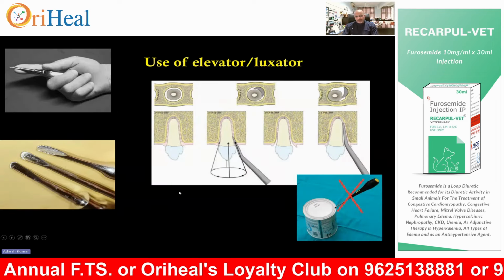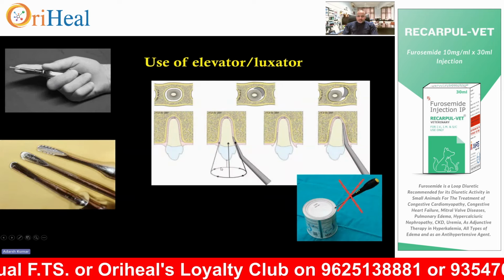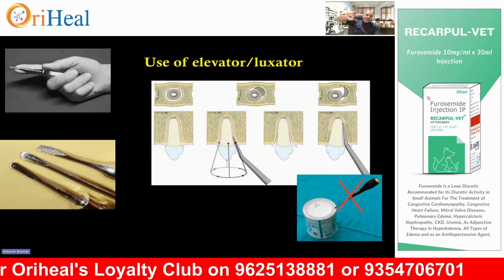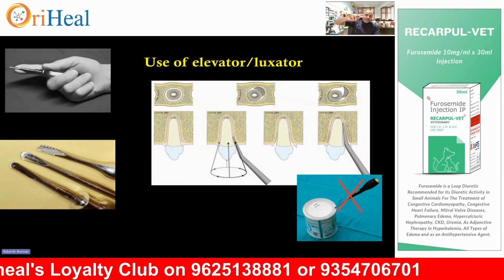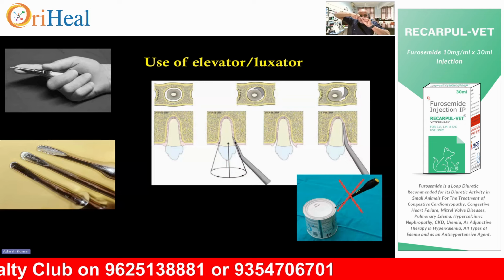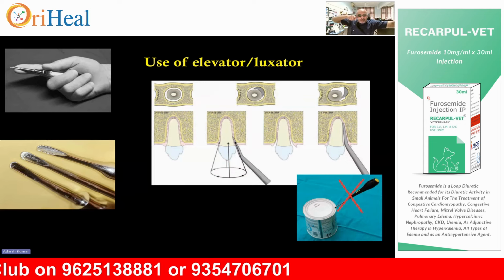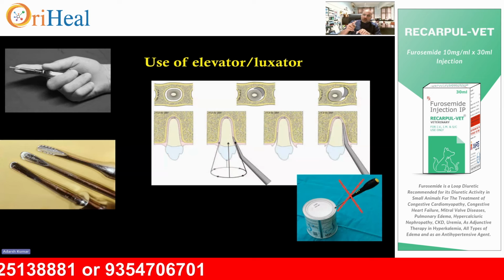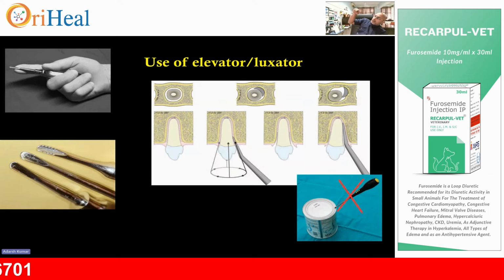So you're going to hold it like this. Why tip here? Because if you hold it like this and you're going like this, it will end up in the infraorbital foramen or can end up in the nasal passage. So protect it. This has to be like this. Hold it from the palm and keep your finger here, right? That much of the space is to be given only. Then you can apply the force.